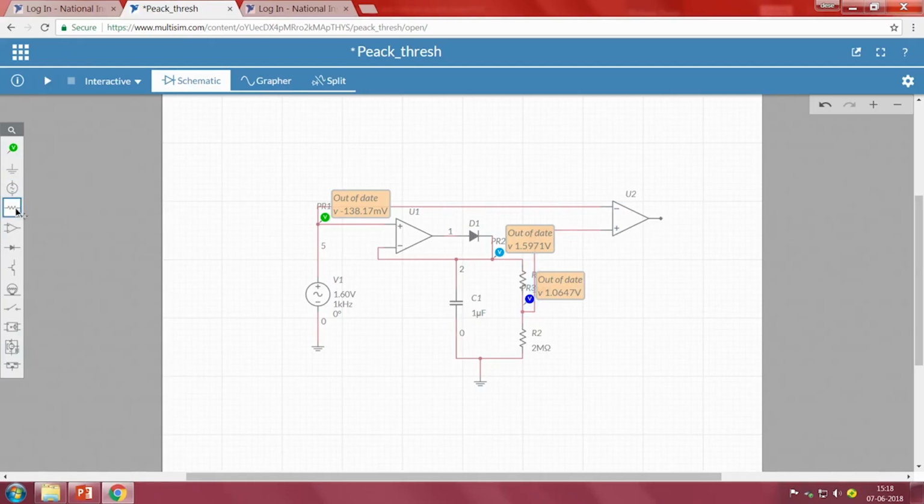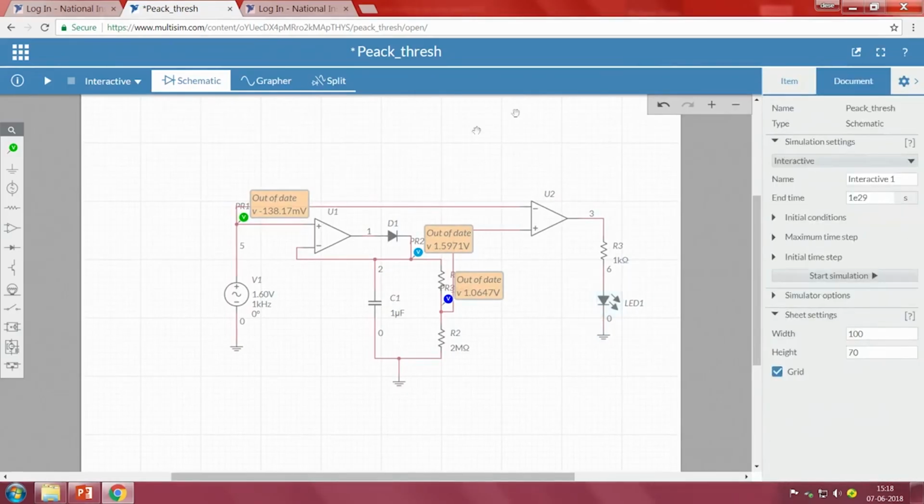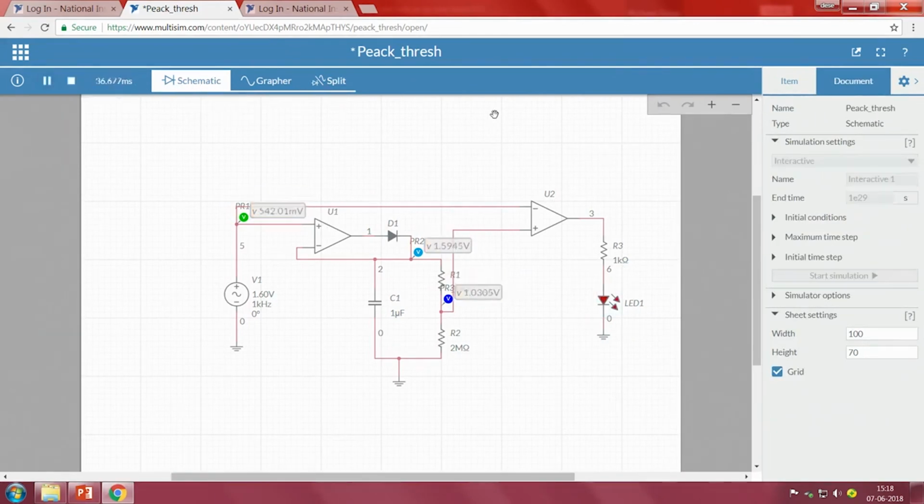Now, just to identify, I will take one more resistor, some rough 1K value, and connect the other terminal to the ground. We will take the same circuit itself, and I will take an LED, connect it here, and one more ground, let me connect it here. The color is red, that is cool. Now, let me run it. Since the frequency is very high, we can see it is continuously glowing.